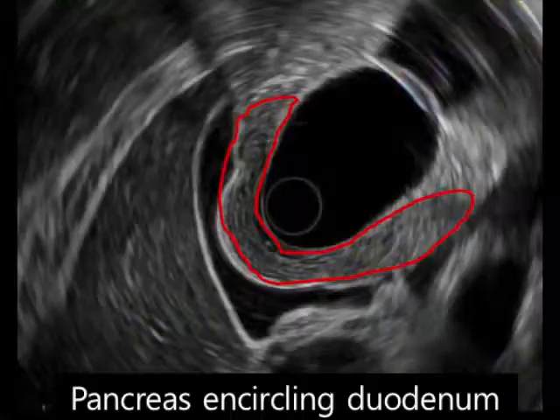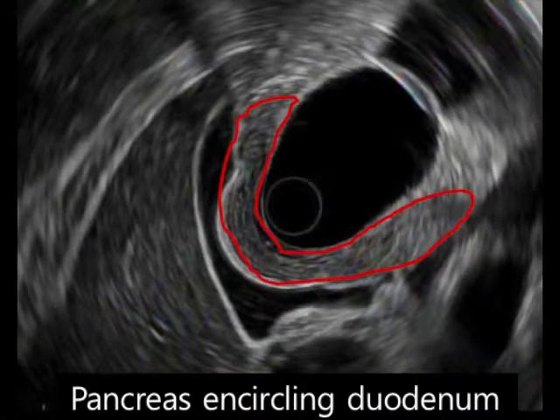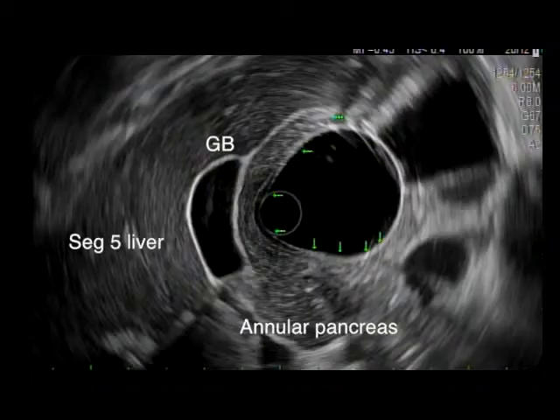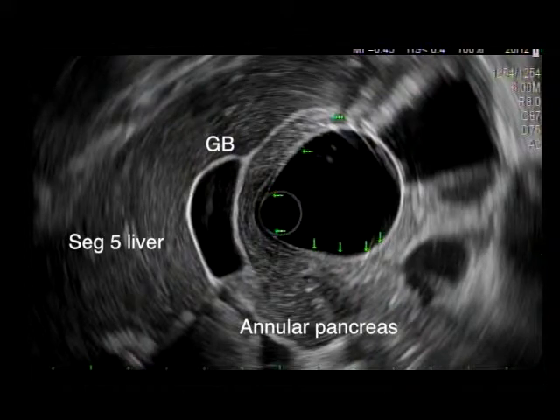This pancreatic parenchyma was almost encircling two-thirds of the duodenal lumen, and the parenchymal echo texture of this part was similar to the body and tail of the pancreas.